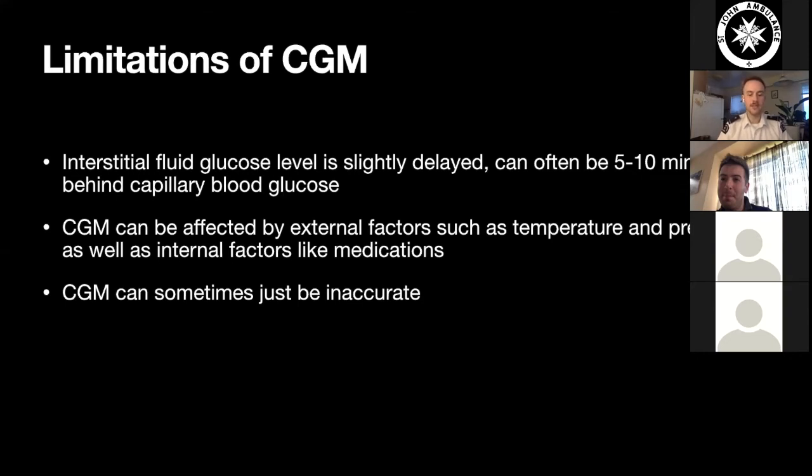And so that's where these newest generations of continuous glucose monitors, the one I'm wearing, the Dexcom, as well as the Libre that you saw there, Health Canada has endorsed them for making treatment decisions off of. Previously they were only really good for giving people a general idea of what was happening, but the company specifically suggested that you do a finger stick to confirm the reading before you gave insulin, whereas now it's approved for that. But every manufacturer will tell you to verify the insulin with a CBG or a finger stick if the symptoms you're seeing in a patient don't match the readings.